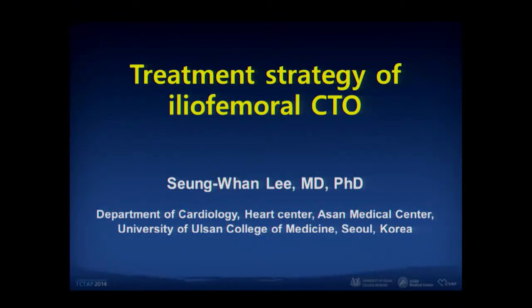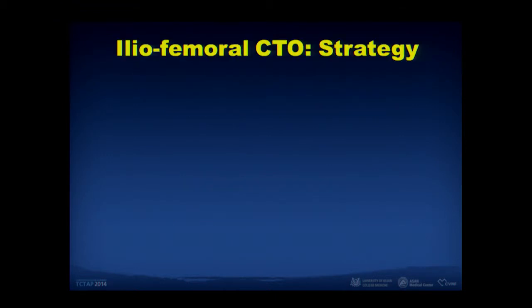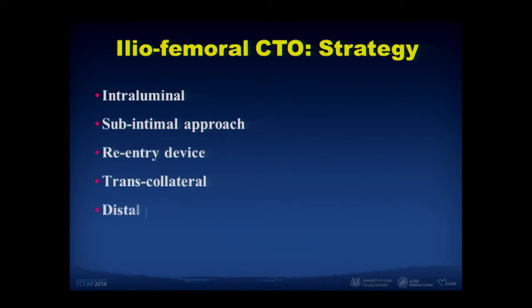It's a great honor to be here and talk about my topic, treatment strategy of ilio-femoral CTO. As you know, the ilio-femoral CTO strategy is the same as for BTK and iliac: intraluminal, subintimal, reentry, transcollateral, distal puncture, and special situations sometimes. I want to talk about this strategy with representative cases.